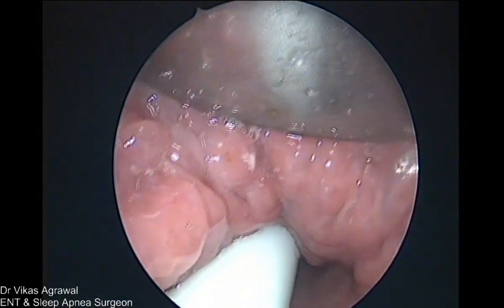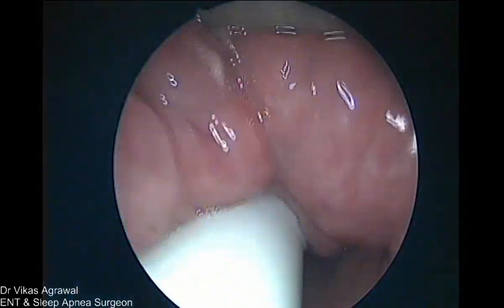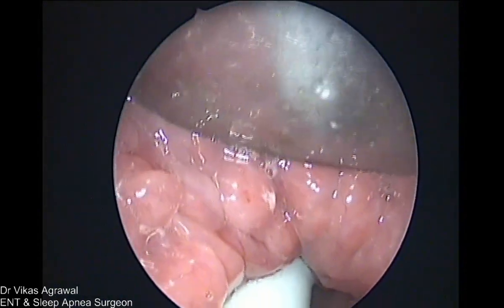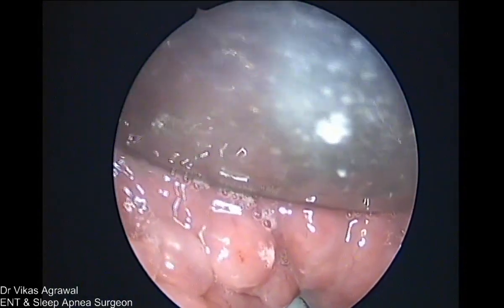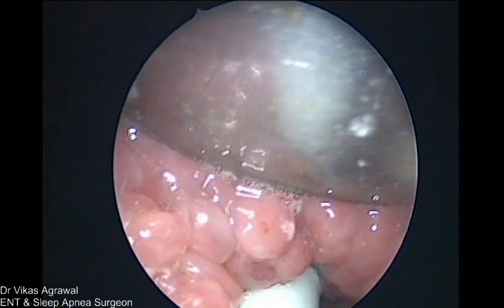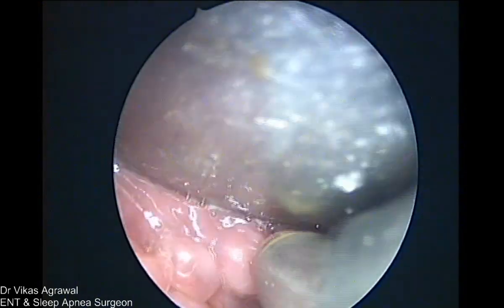Okay, this is perfect. See, this is the epiglottis, this is the vocal cords, right? This is the base of tongue and this is the foramen cecum. Seen very well. This is the area of the foramen cecum. This is the foramen cecum, correct? Not yet. Not yet.